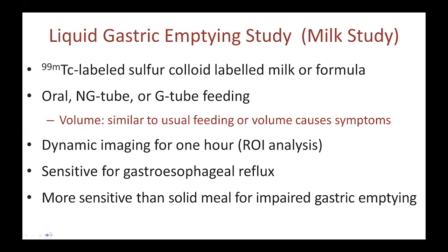This test is particularly sensitive for gastroesophageal reflux. And some studies have suggested that it may even be more sensitive than the solid meal for assessing impaired gastric emptying.